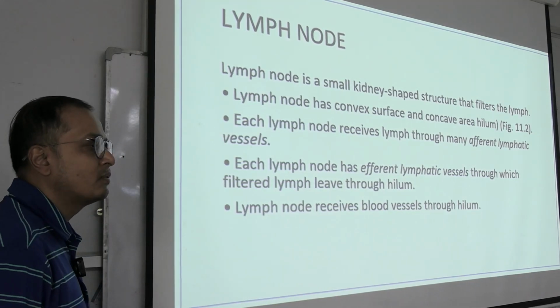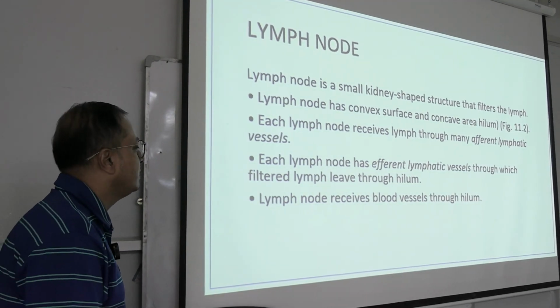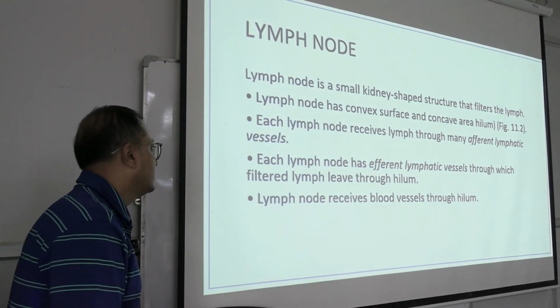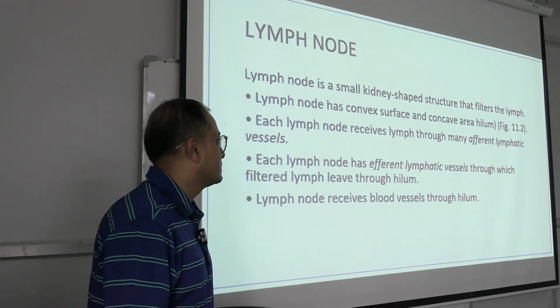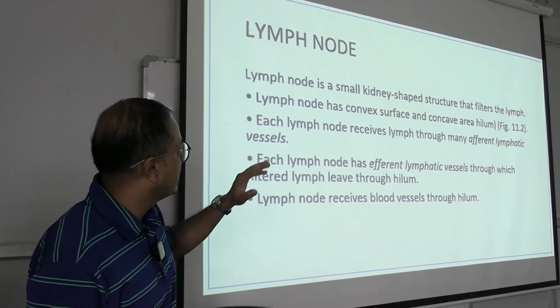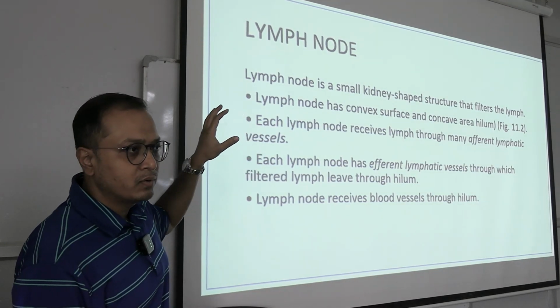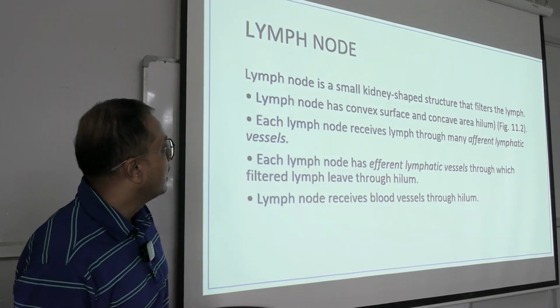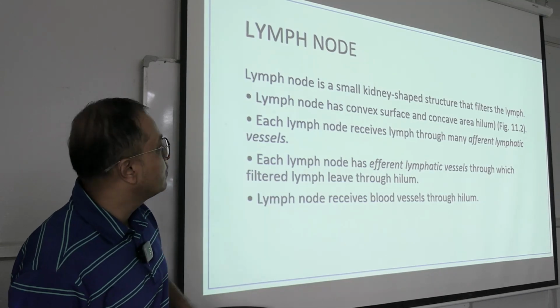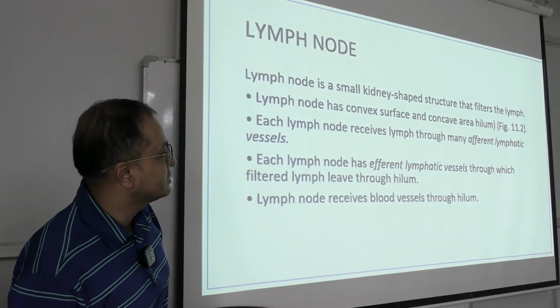The theory portions of the spleen tissue have already been covered, the blood circulation of the spleen and the content of the spleen also in the theory and the practical. I am not going to talk in detail about the spleen, just highlighting the features which help us identify this organ when you are seeing it under the microscope, and why we call it a lymphoid organ, lymph node or spleen.